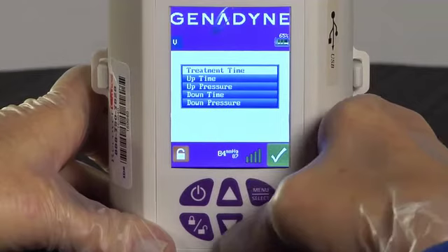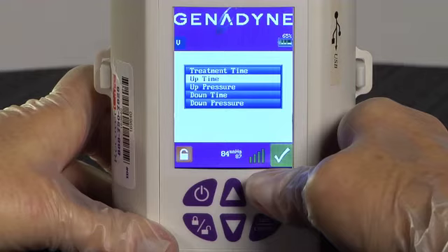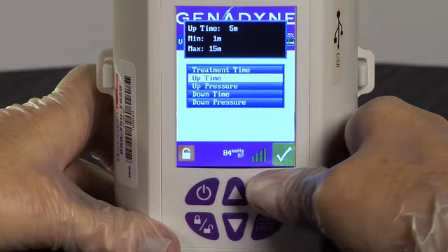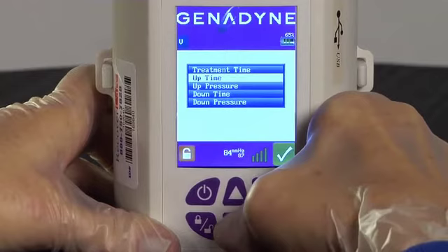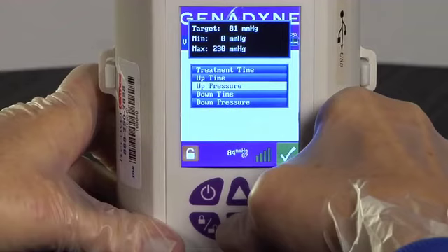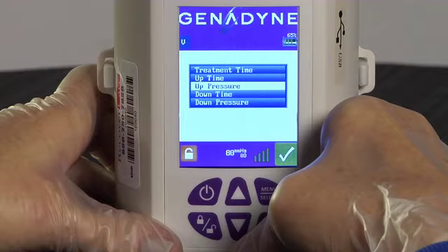The pump will return to the menu. Next, use the Up or Down button to select the Up Time on the menu. The Up Time is the time the pump will draw at a higher pressure setting. Press the Menu Select button again and then, using the Up and Down arrows, set the time required for the pump to draw at the higher pressure. Press Menu Select to confirm the time and scroll to the Up Pressure on the menu. Press Menu Select again to set the Up Pressure. Use the Up or Down arrows to set the Up Pressure to negative 80 millimeters of mercury. The pump is now programmed to draw at a rate of negative 80 millimeters of mercury for 5 minutes during the Up Pressure cycle.